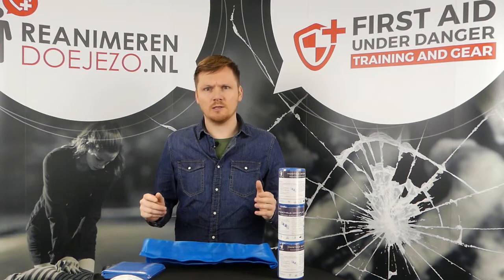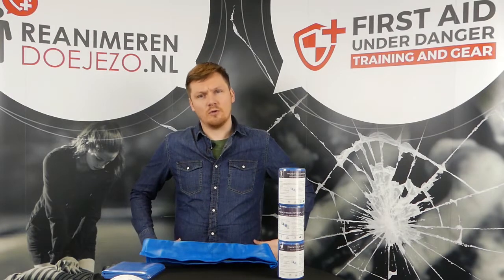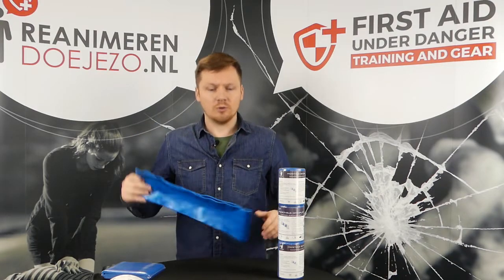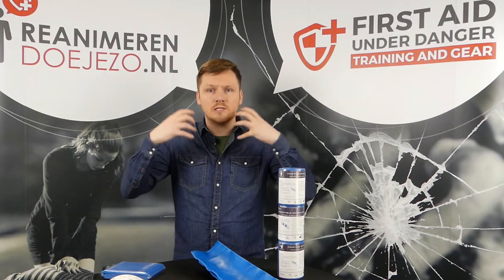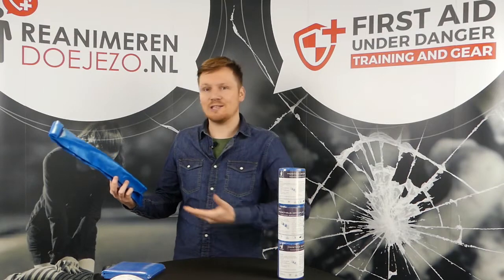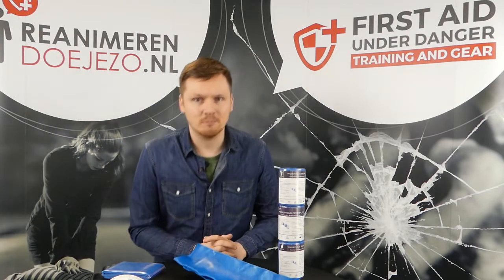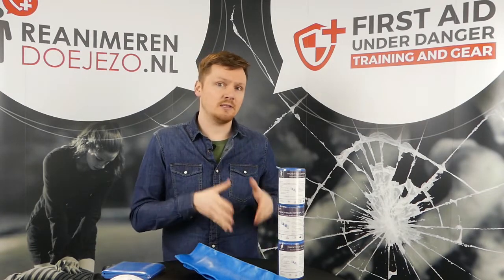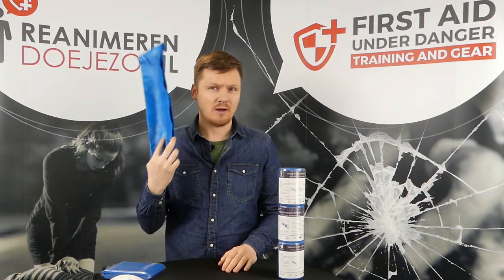I even saw a special forces guy make a pelvic splint for the hips using a combat application tourniquet and a splint — he didn't have a pelvic sling at that moment, so they improvised one. There are a million different ways you can use a splint, so it's important to understand your gear and know how to use it.